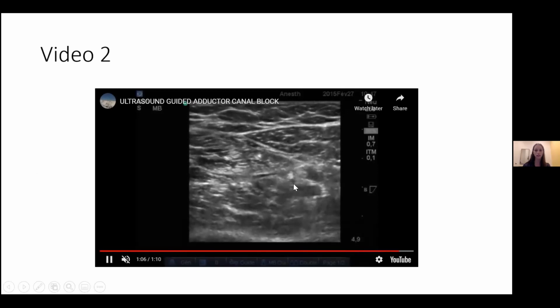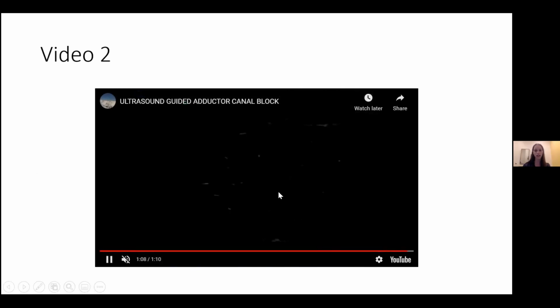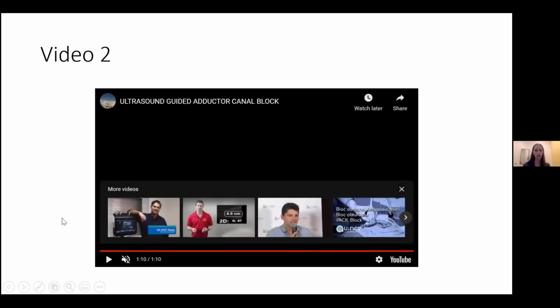So in the first video, they went around 5 o'clock. In this one, they went around 1 o'clock. So both are avoiding what they think is the saphenous nerve.